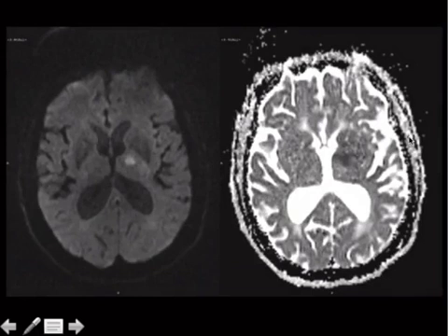So there's a thing called ADC, apparent diffusion coefficient, and I'm sure you know that ADC is necessary to read diffusion correctly. So an ADC map is calculated by obtaining a set of images without diffusion gradient, which is like the poor man's T2, and a set of images with diffusion gradient. And then you do a logarithm of the ratios. Low signal is true restriction, and high signal is T2 shine through.